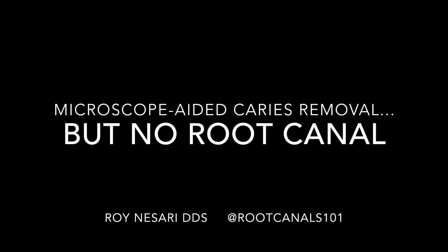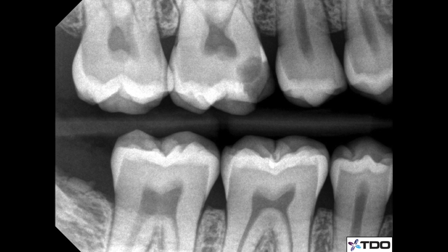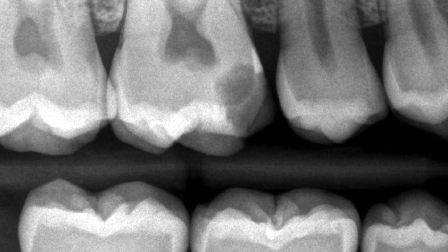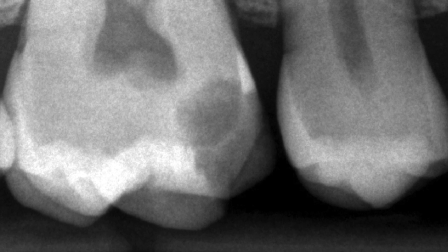Hi again, Roy Nassari, sharing another case with you. In this particular situation, upper tooth number three had deep caries, but the bite wing showed that there's still a chance that we could avoid a pulp exposure. No symptoms, just food impaction, just restoration may have broken off — he doesn't remember.